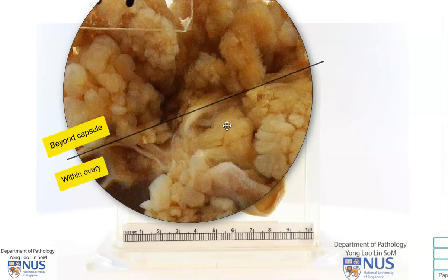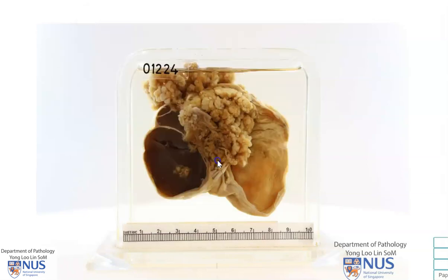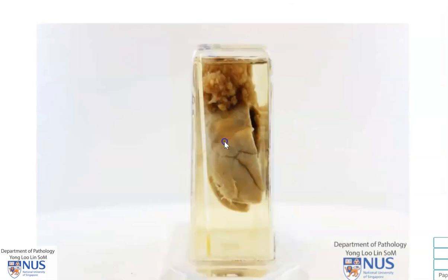This tumour appears to be invading into the cyst wall, which is essentially the rest of the ovarian compressed parenchyma, and going all the way extending to the serosal surface. This is a feature of malignancy, and we can see clearly that this is the tumour that is beyond the serosa.